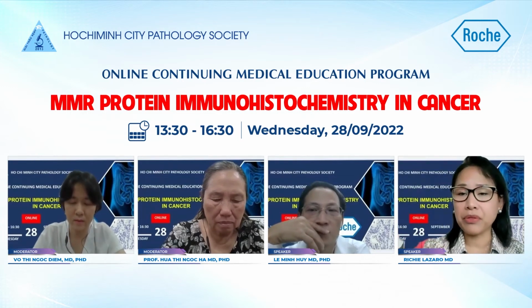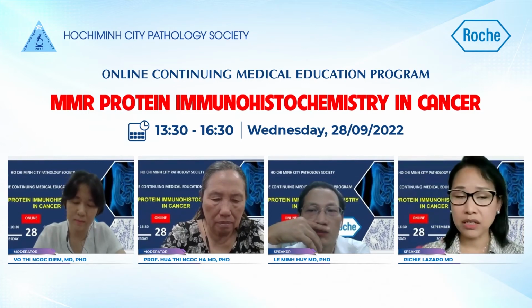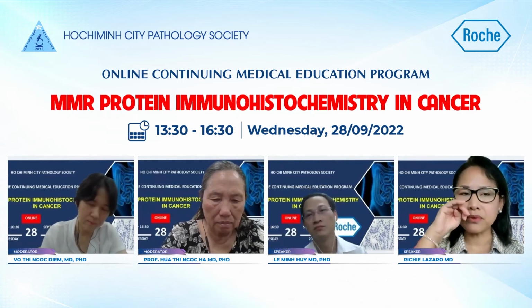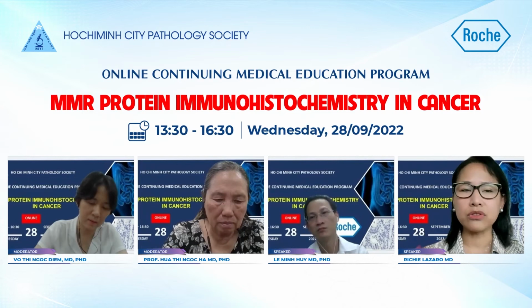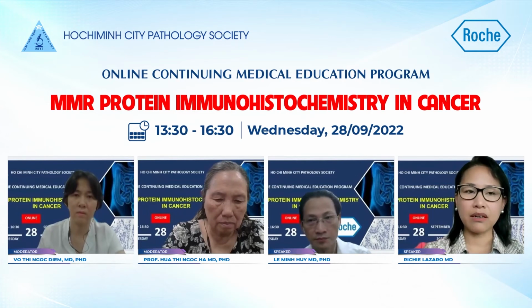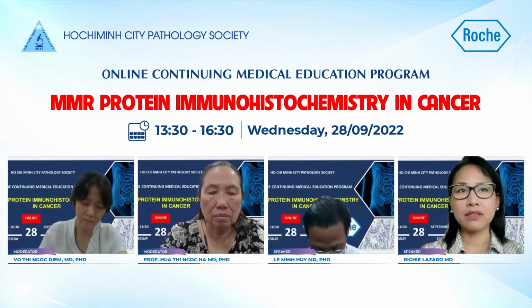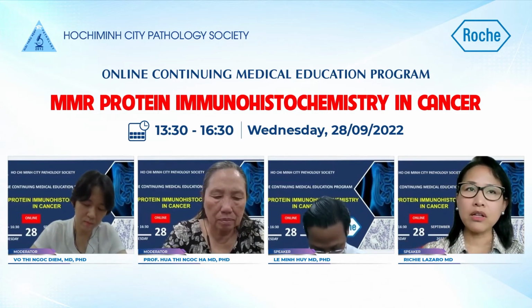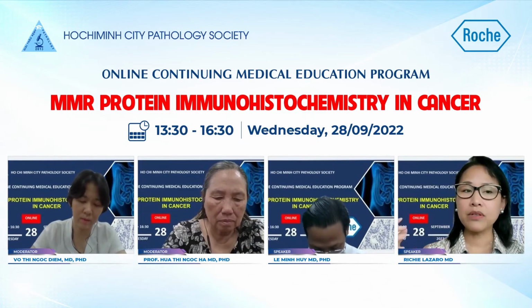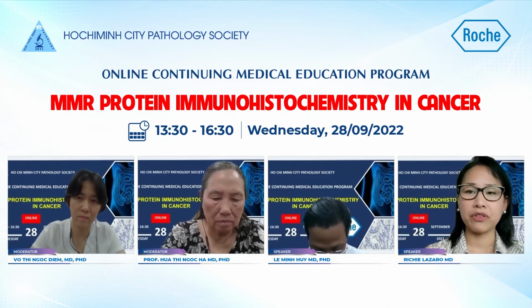However, as a pathologist, we always put our interpretation in the context of the clinical background and the clinical scenario. So, for example, if there is any doubt as to why it is focal or whether or not there might be a staining issue, as mentioned in my talk, the pathologist can choose to either repeat the staining in another specimen or confirm it with MSI or another confirmatory method like NGS.